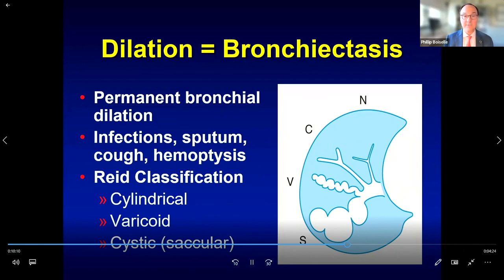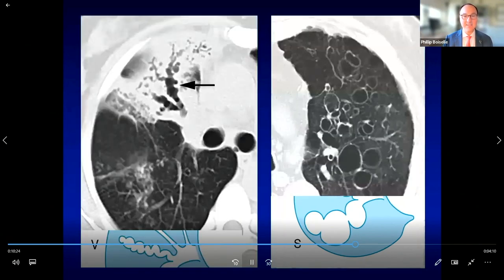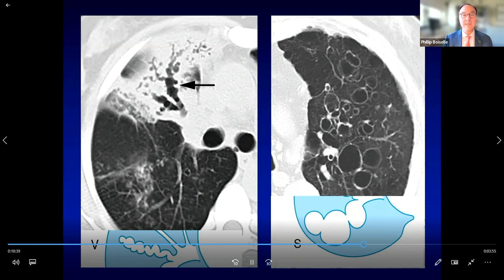Cylindrical bronchiectasis shows non-tapering bronchi; varicoid has a serpiginous appearance; and cystic has a saccular appearance. CT examples show the varicoid pattern on the left in a patient who had radiation therapy — with serpiginous dilated airways — and the cystic pattern on the right in a patient with cystic fibrosis, showing balloon-like saccular appearance.